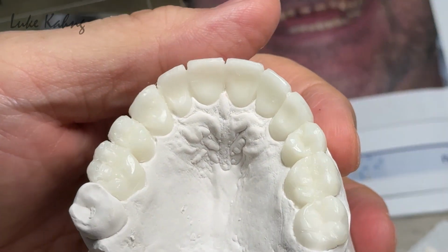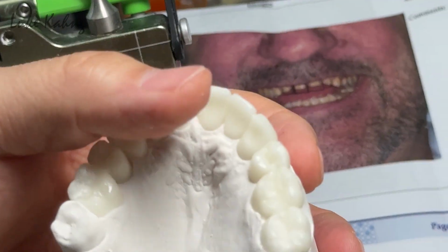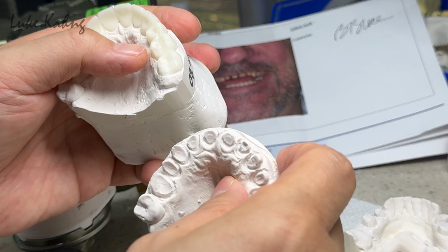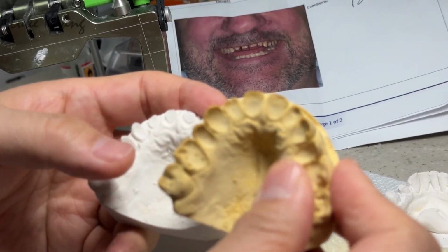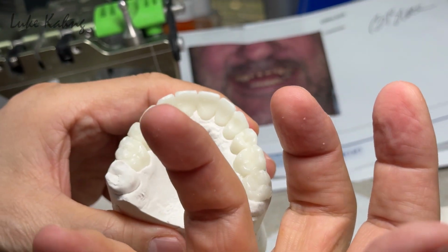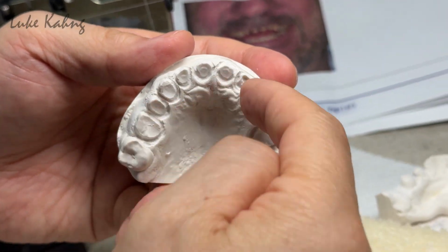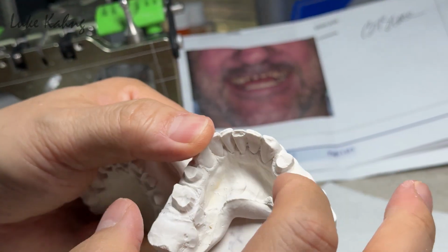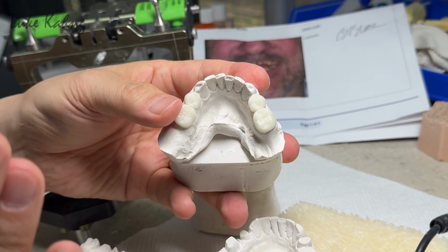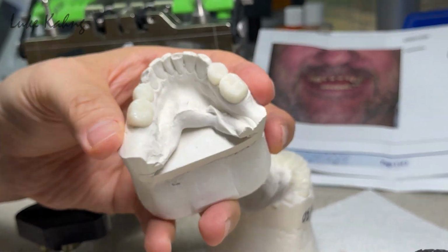Now we're going to make the dupe model for this. After the dupe model, I make another stent and then push it, because I prep the teeth like this. Right? Here is the before, here is the prep, here is the finish. After making the dupe model with a stent, I'm going to put acrylic on top of that. So then I can get the teeth, the lower, top and bottom. And then we're going to finish another temporization. So that's why they need the diagnostic wax-up, otherwise you cannot get a perfect temporization, which is really detailed when I finish it.